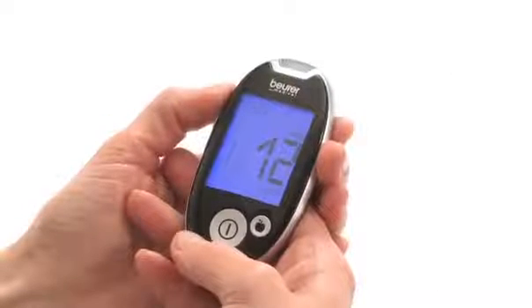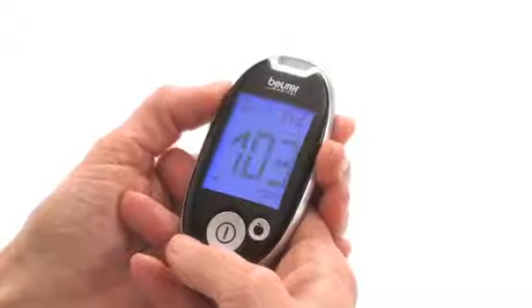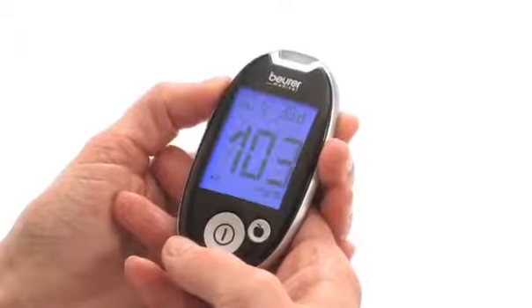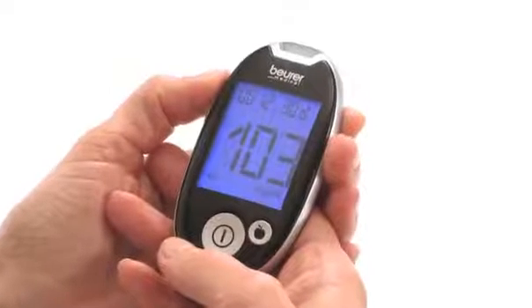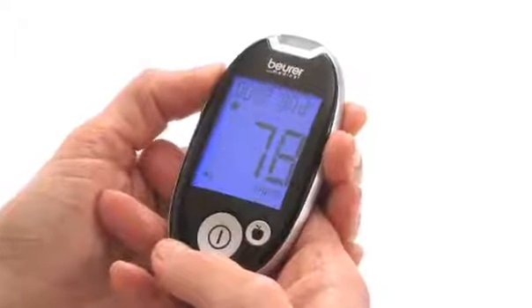From the 480 saved values, the average blood glucose value can be calculated for 7, 14, 30, or 90 days for all measured values and marked values.